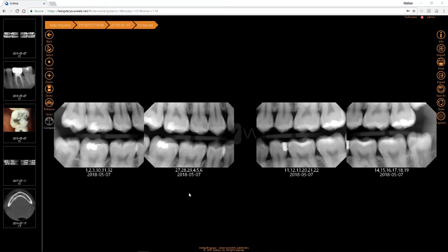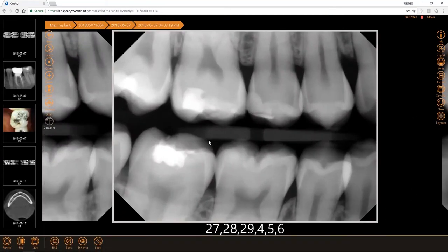In this tutorial we will be going through the steps on how to use some of the most common image manipulation tools in XvWeb. First you'll select the image that you want to use these tools on by simply clicking on it. It will enlarge the image full screen.